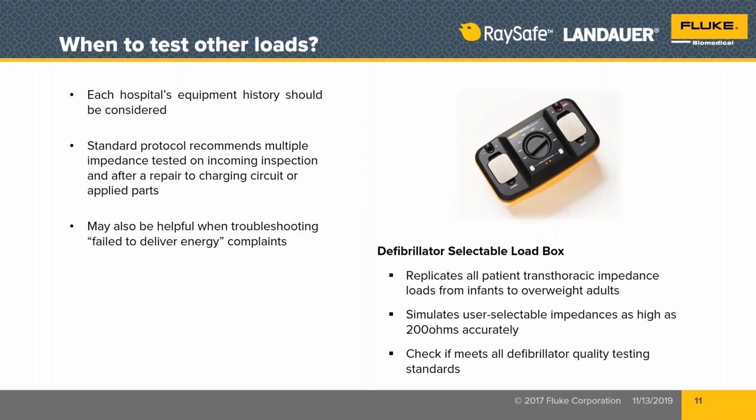So you can see that tells us that the defibrillator output energy guarantee is properly functioning. Why? Because a lower load or a bigger load, it still delivers the value that I need it to deliver. You cannot see that if you only have a 50 ohm load. You'll never be able to see and challenge that functionality.